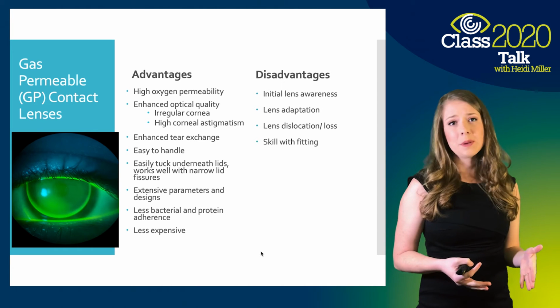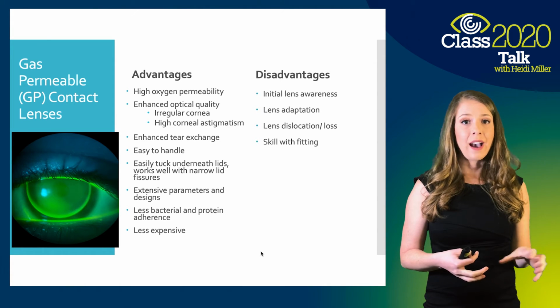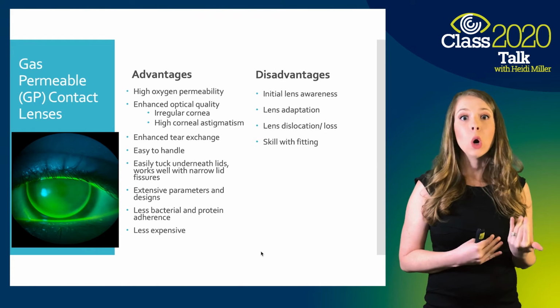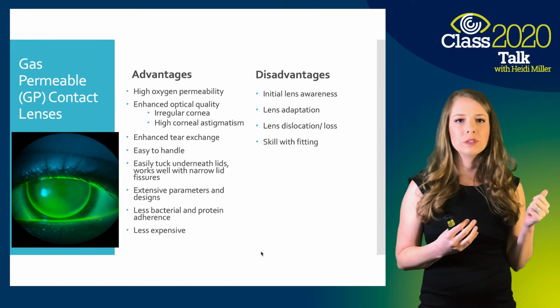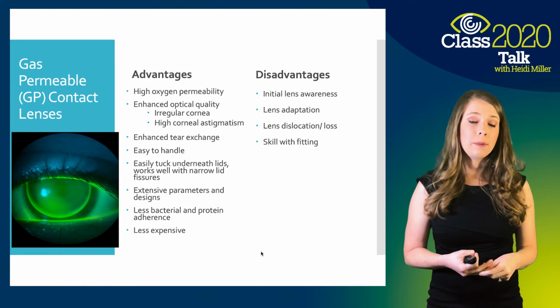And they're aware that we're going to be replacing the lenses often in the beginning because of parameter changes, but it's nice to know that they're easy to find, they're easy to clean, and it takes a little bit of that stress off if they lose it at home. If they happen to find it, they can just put it through a cycle of cleaning and still use that lens. So I've noticed that that's been really helpful, especially for the lens loss type of patients.